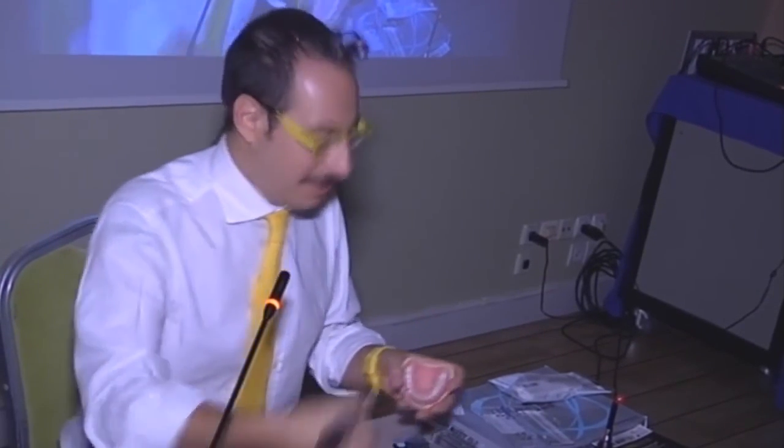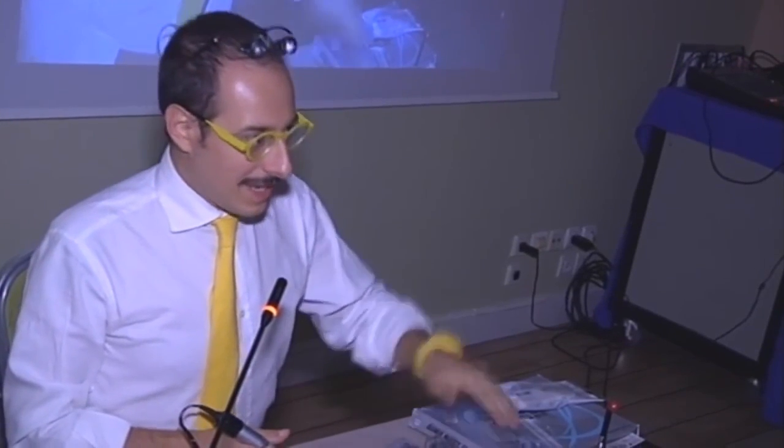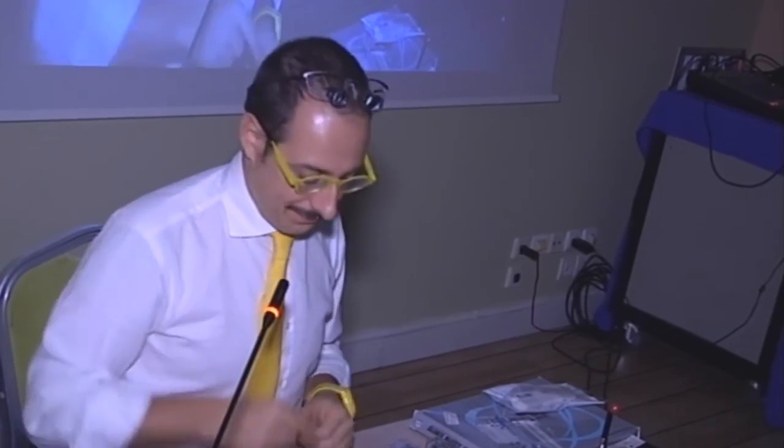So it's really mandatory in anterior teeth, of course, because otherwise you can stay hours with the brush like this, and you will not obtain any glossy surface, because there is the monomer, which is uncured, on the top of the surface. So you light cure the last layer, place the gel, and light cure again. 10 seconds, 10 seconds.